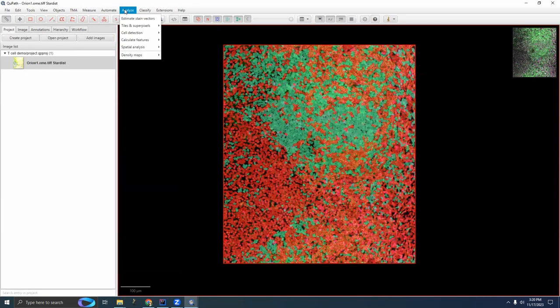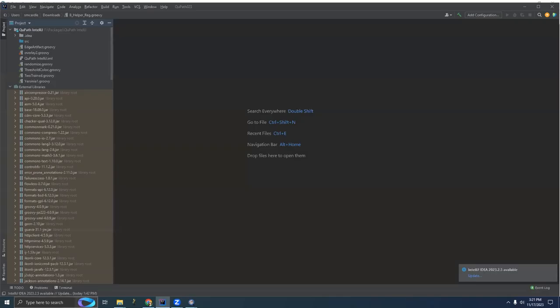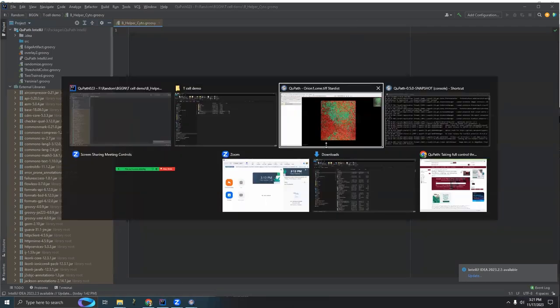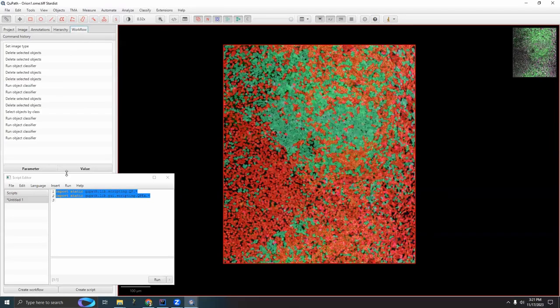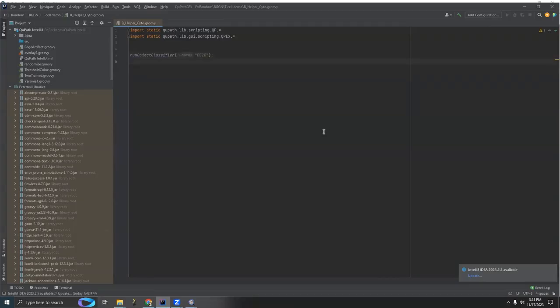Before, I'd like to open up my script editor and start by importing some real basic import statements. And then go into IntelliJ and open up a brand new file with nothing in it and copy paste these import statements. Then let's rerun the CD20 classifier. Where was it? Here. So I'm going to copy this and run the CD20 classifier.